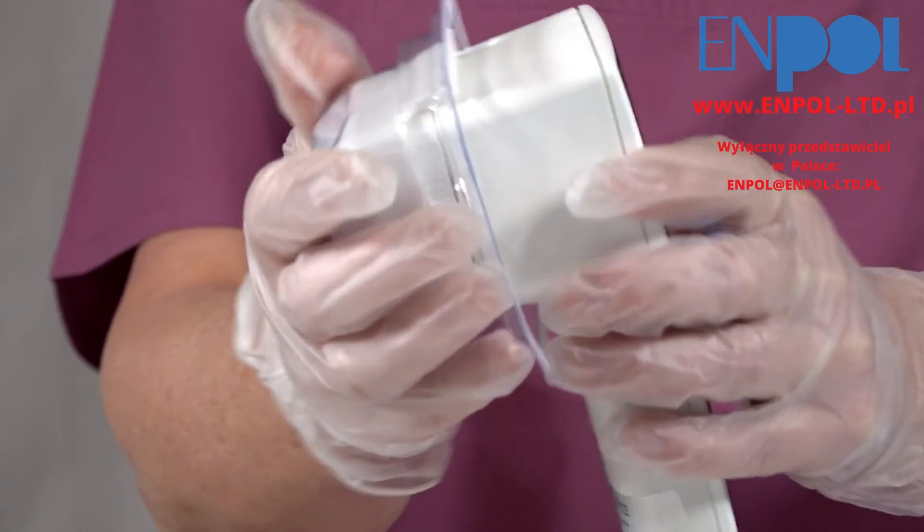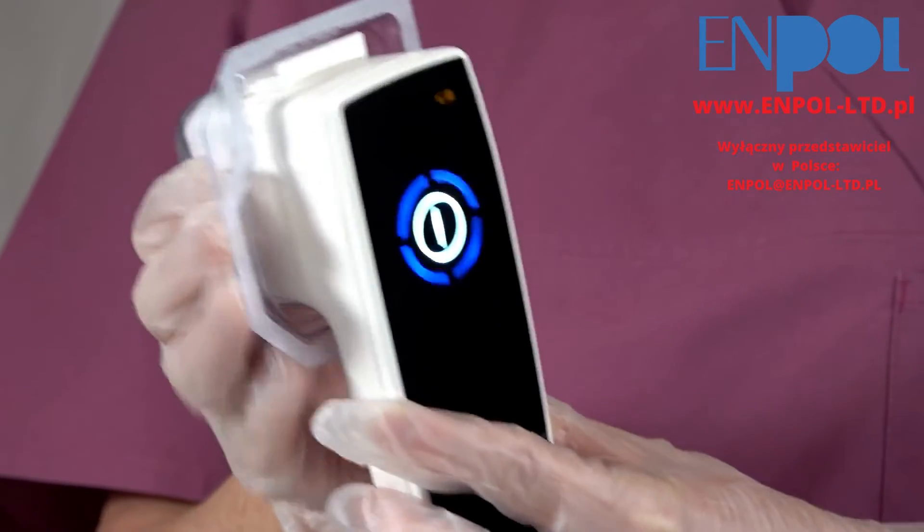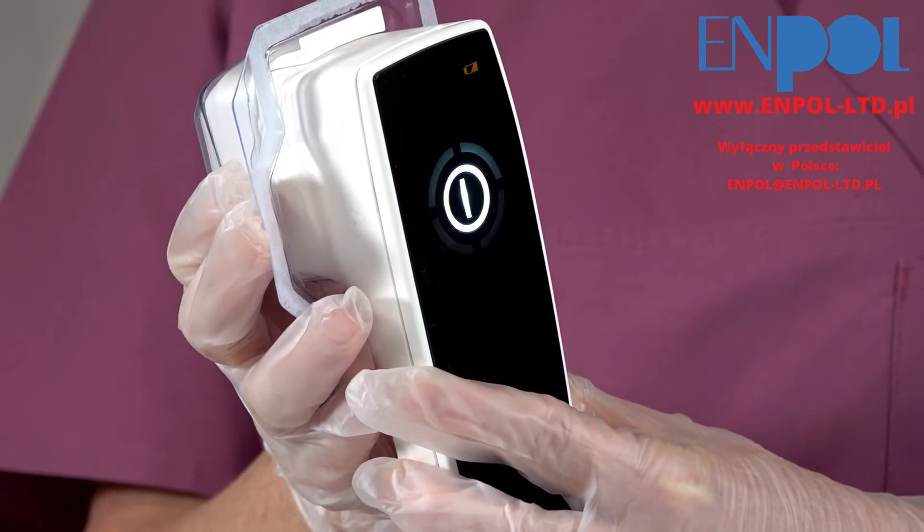Initialization of the device begins. Once the initialization is complete, the plasma ring indicator light will turn continuously blue and the treatment can start.